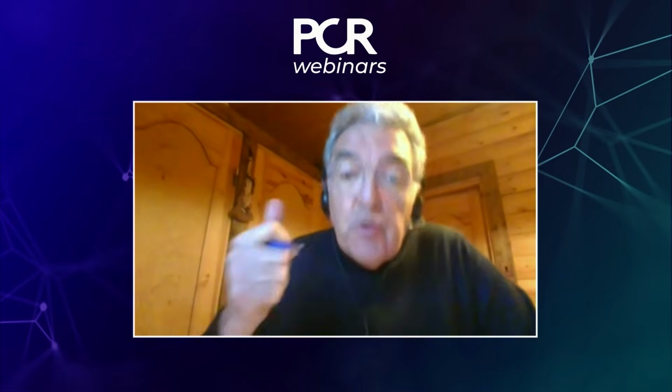Thank you. It's very clear. So we learn. Thank you, Goran. Again, we learn a lot. First, we have all the time to treat it. We cannot leave this kind of dissection in the left main. And second, you insist, Goran, on the usefulness of the IVUS assessment in order to be sure that we will place the wire in the right channel.